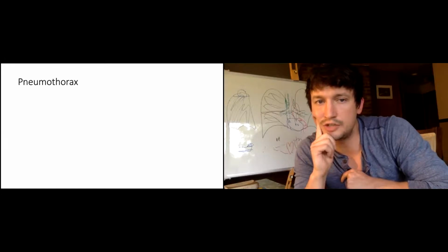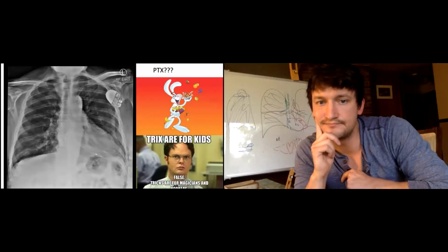Okay, let's talk about pneumothorax. Next slide. What do you think here? When I'm looking for pneumothoraces, I want to make sure I know which position they're in, if they're erect or supine, because the air is going to rise, so I'm going to look for the pneumothorax in different places. This one's erect, so I pay special attention to the apices.